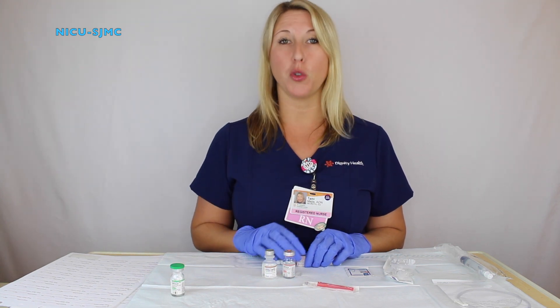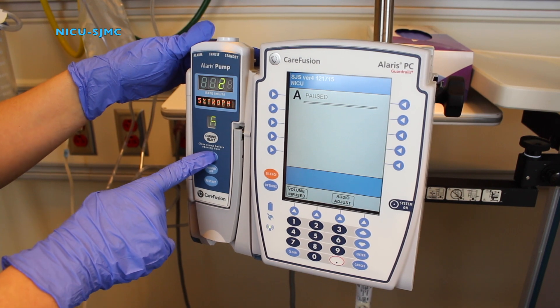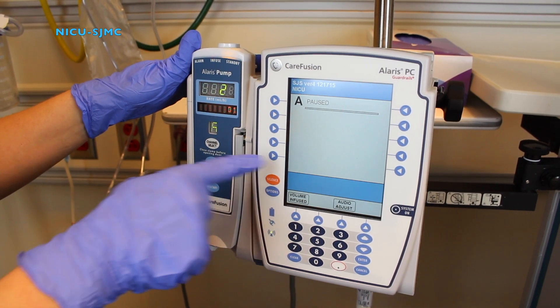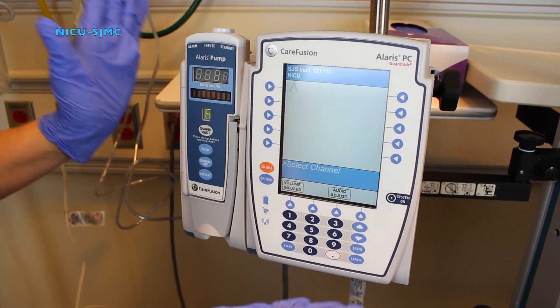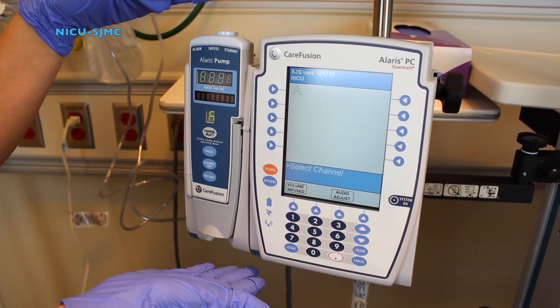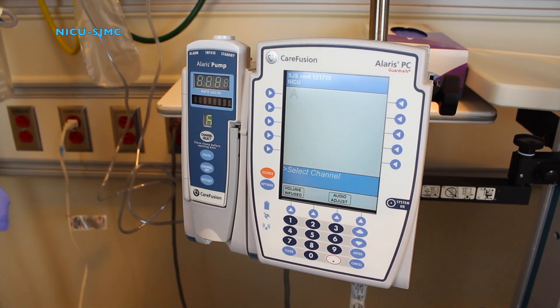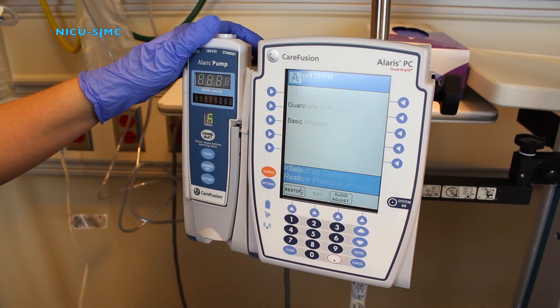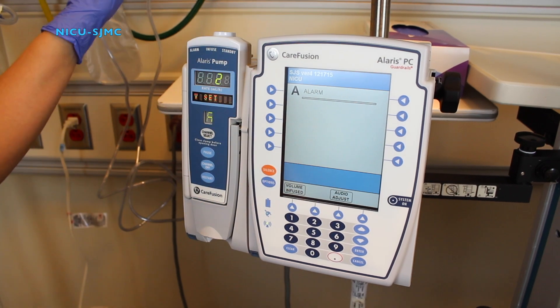Make sure after the flush has completed that you restart your TPN. To pause TPN: come over and hit pause, then press the channel off button and hold it until you see 'powering down' appear. Press any number — press 5 — and it will go to a standby screen. It will not alarm continuously and it will keep all of your information and fluid volume infused saved. Let your ampicillin run on the metafusion pump. When ready to restart your TPN after the flush, press channel select, then restore and start. Your fluid will immediately begin infusing again.